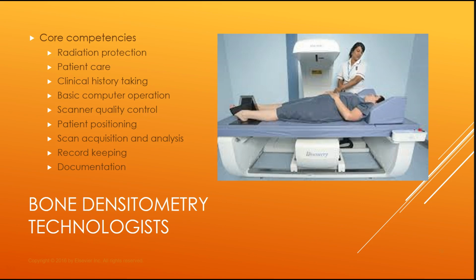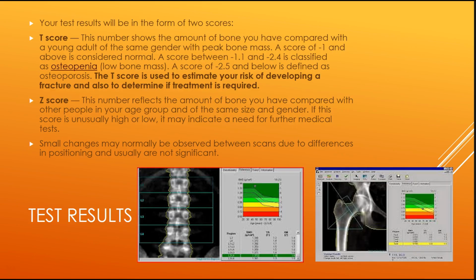How to operate the machine is very important. There are 3 different manufacturers for Dexa, and machines do not talk to each other, so different software, you can't integrate those Dexa scan results. So the techs need to know how to operate the machine that they are using specifically, how to keep an electronic record, and how to do their documentation.